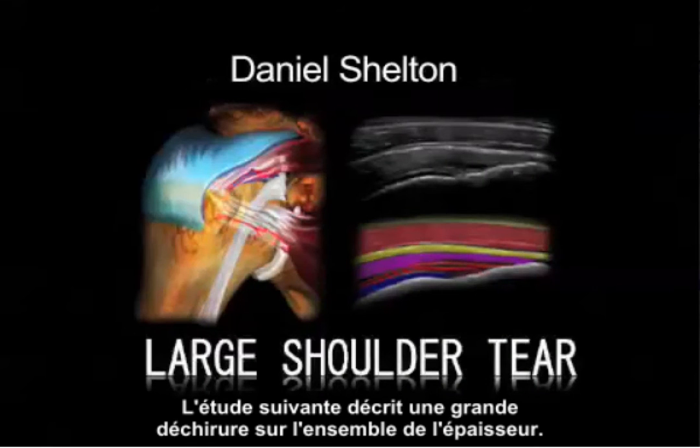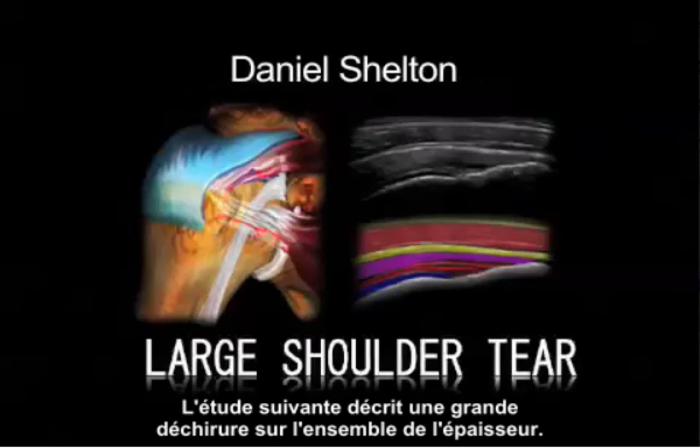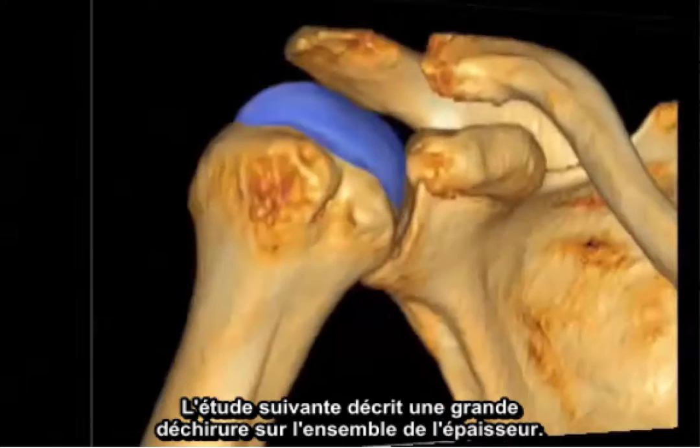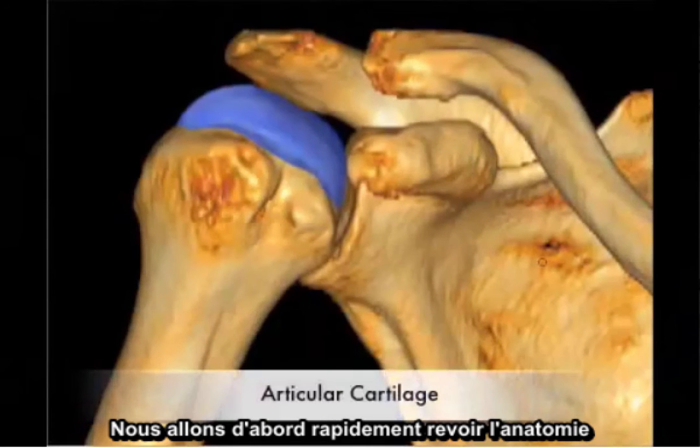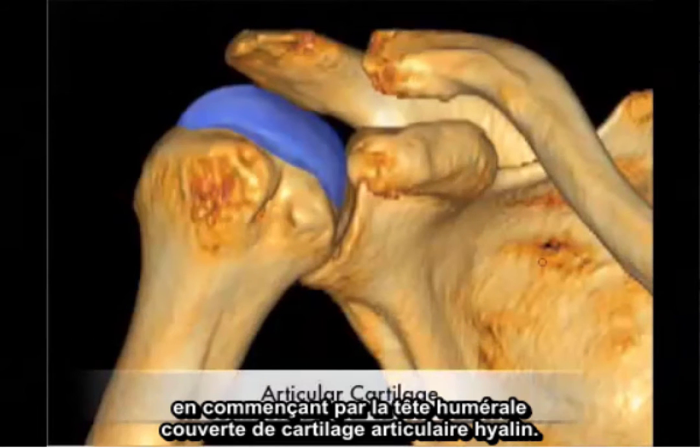The following study describes a large tear with full thickness communication. First we'll describe a brief anatomy review.